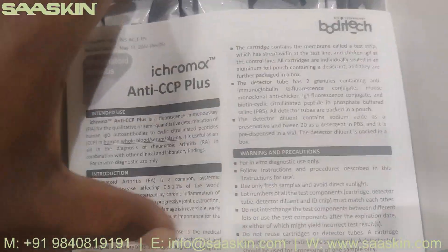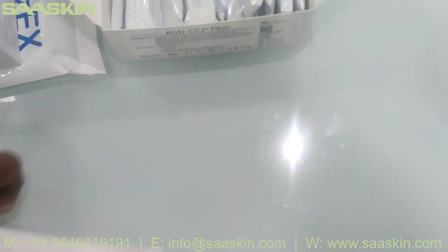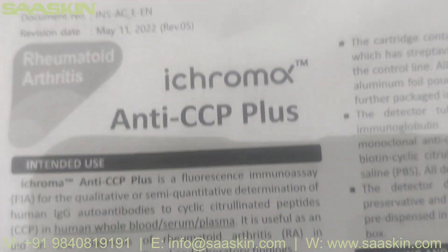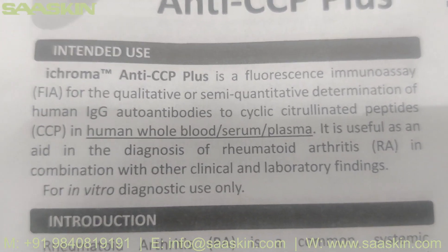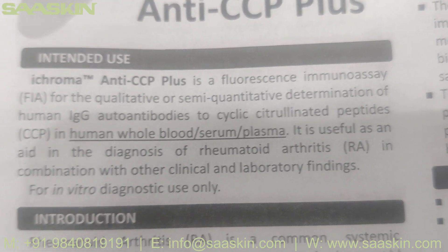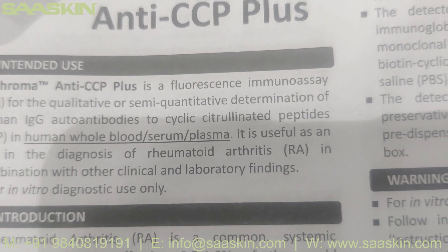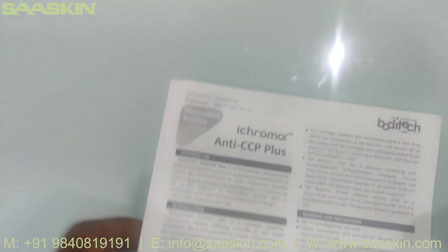Inside the box you can see there is one IFU brochure. It says clearly: the i-Chroma Anti-CCP Plus is a fluorescence immunoassay for the quantitative or semi-quantitative determination of human IgG auto-antibodies to cyclic citrullinated peptides in human whole blood, serum, and plasma. It is useful as an aid in the diagnosis of rheumatoid arthritis. This IFU brochure has complete instructions about test preparation, how to conduct your test, and how to interpret your results.